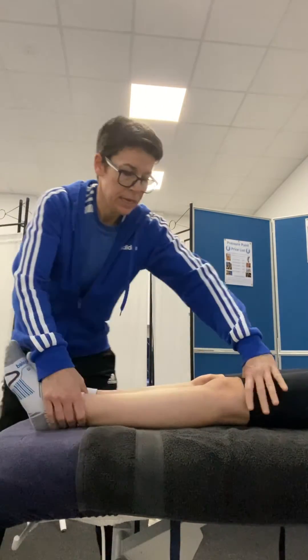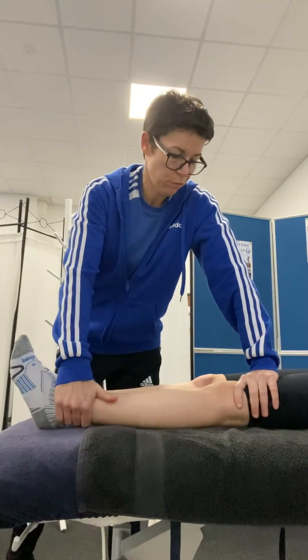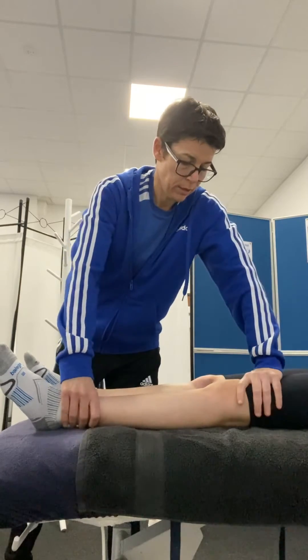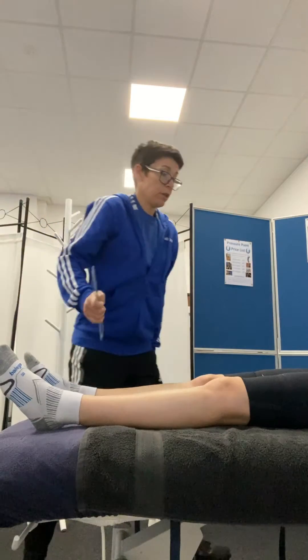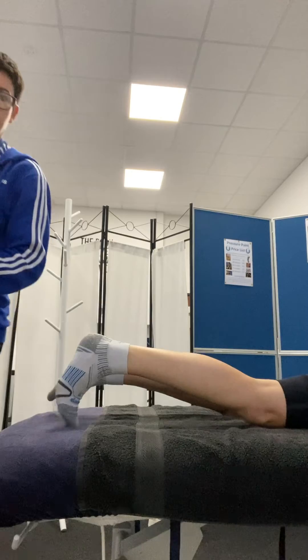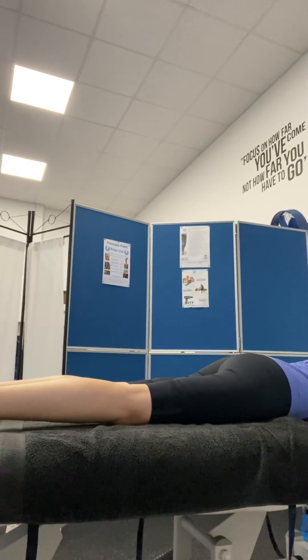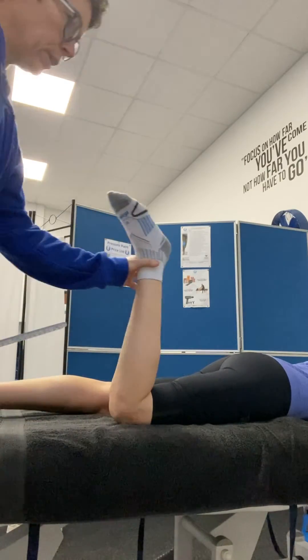I personally find it a lot easier for the massage therapist to have a feel of the range of movement and compare left and right, rather than actually using a goniometer for that one. But if we go to knee flexion, get the client to roll over. For this one, we're taking the heel to the bottom.